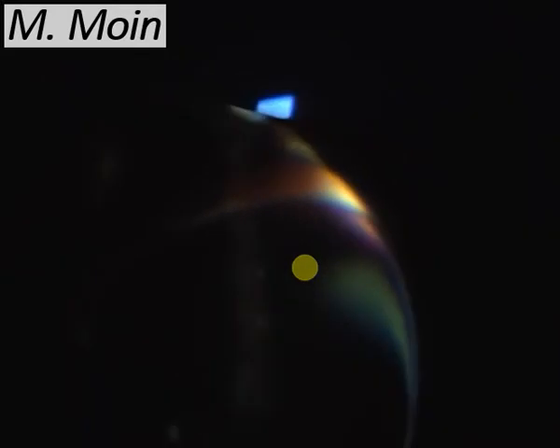Trying to look at the posterior segment to see for any choroidal detachment. Looking through the air bubble sometimes can be difficult because air tends to magnify that image which you're seeing at the back of the eye. So that sometimes can be challenging, but if you can go through this area, usually it's pretty simple. So this patient did not have any choroidal detachment.